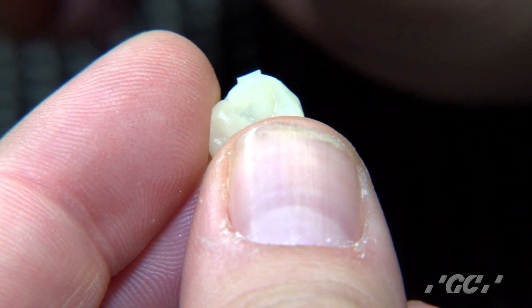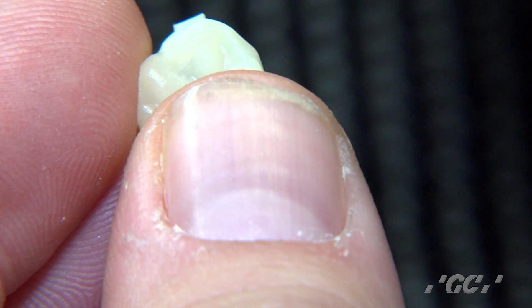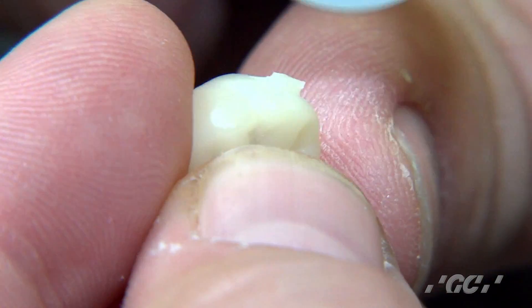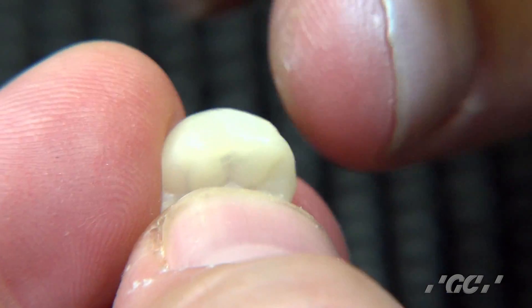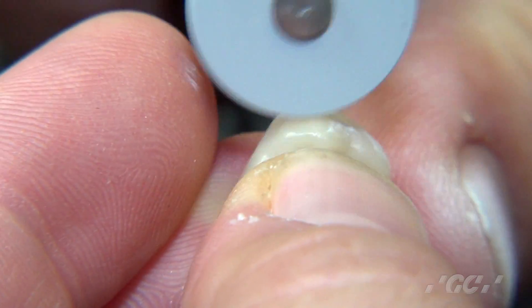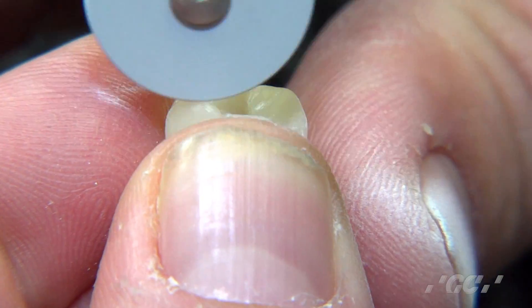The first step is we're going to take a semi-coarse rubber wheel. This is the laboratory version of this rubber wheel. They also have the operatory version of the rubber wheel that you would put in at high speed. So what we're going to do is make sure we remove this button — this came straight off the mill. The next step is to take the same rubber wheel and lightly go over the surface of this restoration to get rid of any burr marks, being very light so as not to take away any of the anatomy, just to get rid of those burr marks.